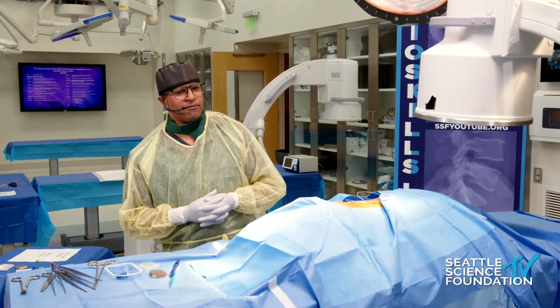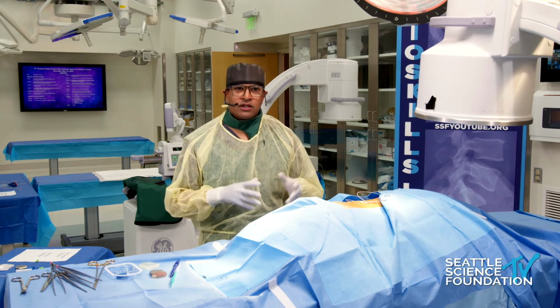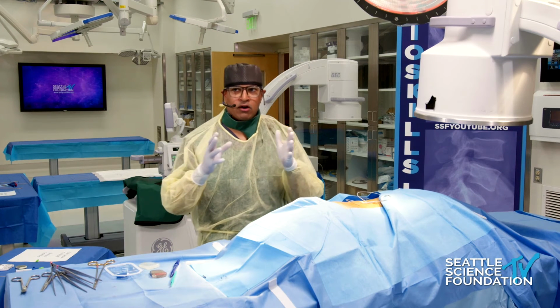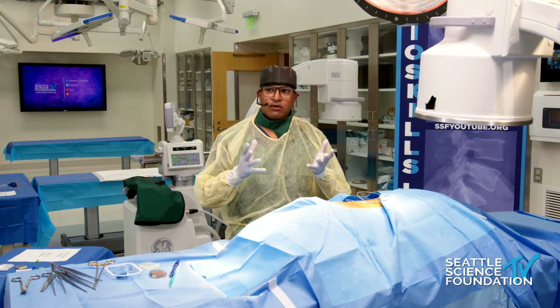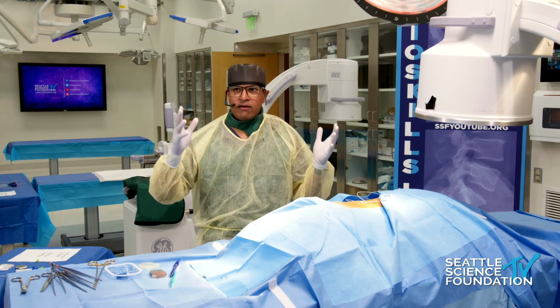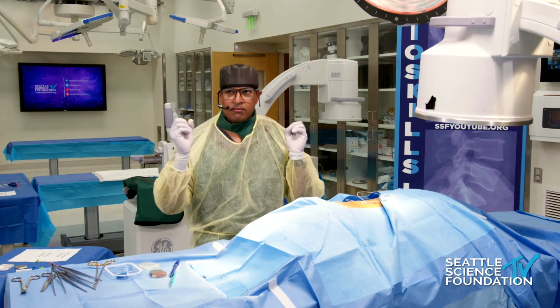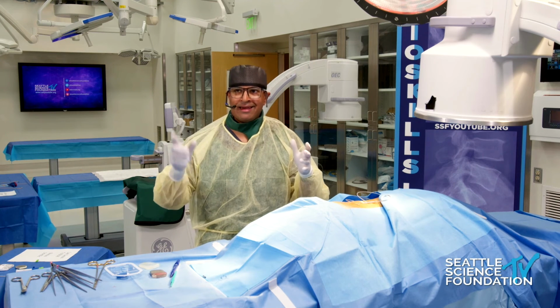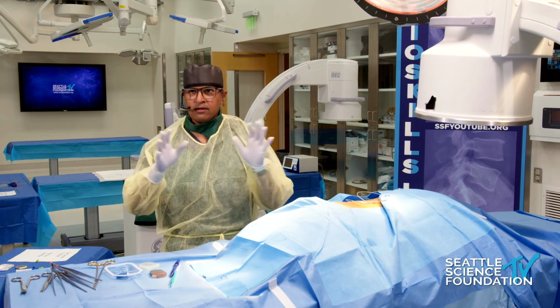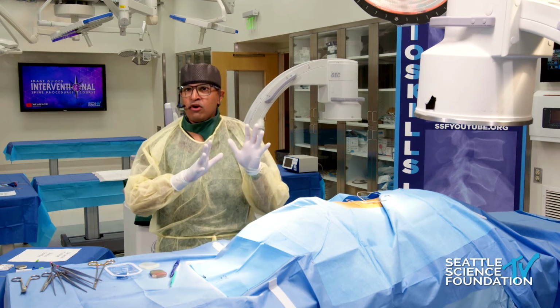Great question, Doug. So one of the things I did not describe was the use of multi-phase, which is a novel paradigm in stimulation. I don't want to call it a different waveform. It's the way the stimulation is actually applied to the spinal cord. So no matter what kind of waveform you use with any of the other companies, you're generally using an anode cathode array and then providing that particular mode of stimulation, and then you can add in cycling, so how often it's on versus how often it's off. No matter what you use, HF10, burst, that's really been the paradigm.